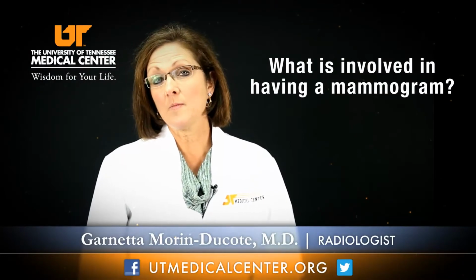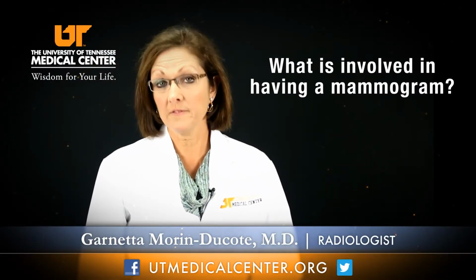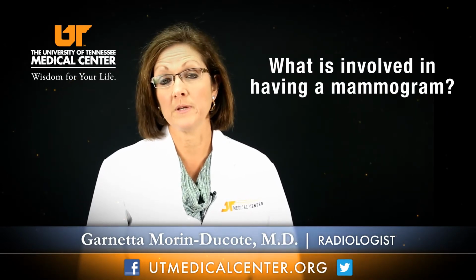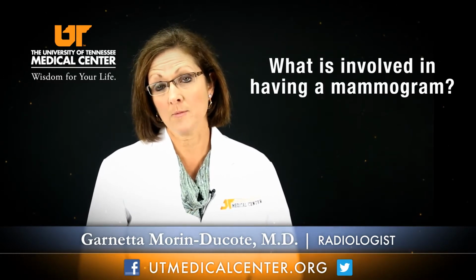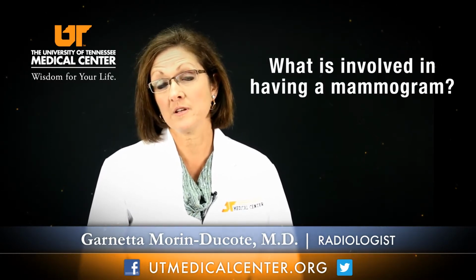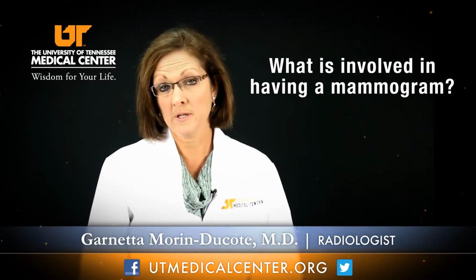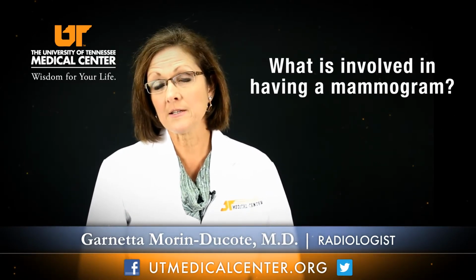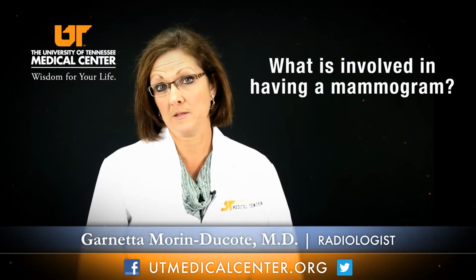When a woman comes to have a mammogram, there are two types that are currently performed in the United States. One is called film screen, and that's like a photograph, like when you used to take a camera with the 35 millimeter, you actually have a printed image. The other way is called a digital mammogram, and about half to 75% of our facilities now in the country are digital. Not everyone is digital, so a lot of people assume that it's called a digital mammogram. It is still a technique that requires radiation because that allows us to penetrate the breast.